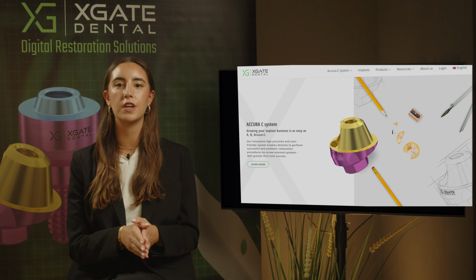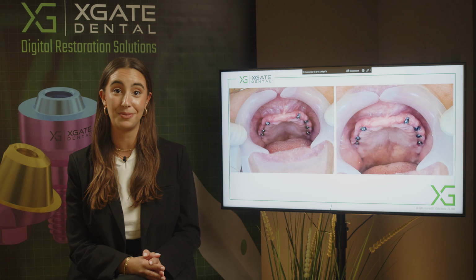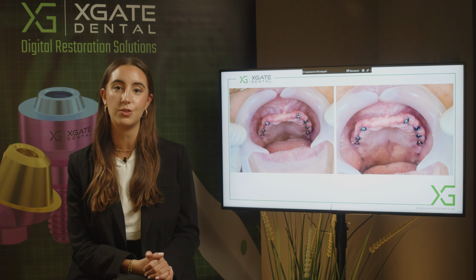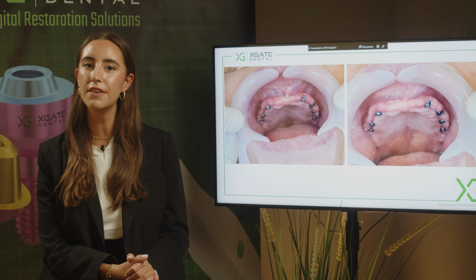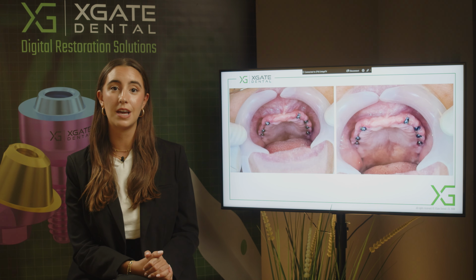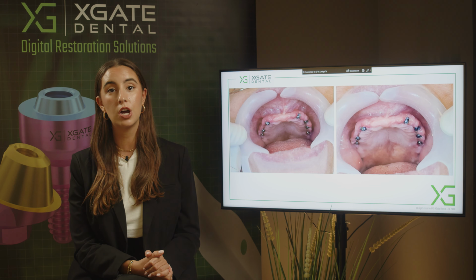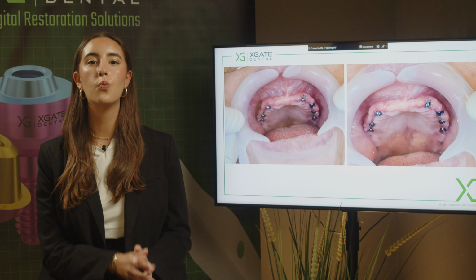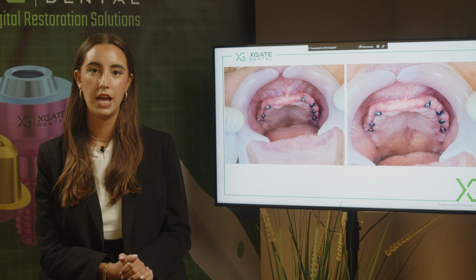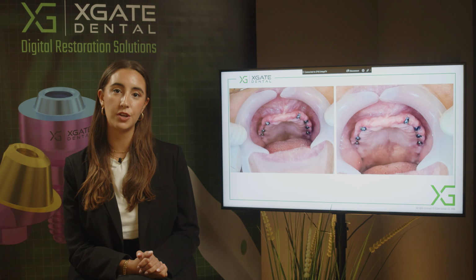Today we want to make a bridge on the upper jaw, a 12-unit, 12-crown bridge on 7 multi-units, on 7 implants. And the biggest problem with this type of restoration is determining the height of the bridge and the occlusion. Now in this case, the patient doesn't have any provisional bridges and doesn't have any teeth at all. On the lower jaw, they have a temporary bridge on their teeth, and soon it'll be changed into a zirconia bridge, but on the upper jaw, we don't have anything. So we need to know what's going to be the height of the teeth and what's the patient's vertical dimension of occlusion. We want to know where the central line should be and all the anatomical configurations of the bridge.